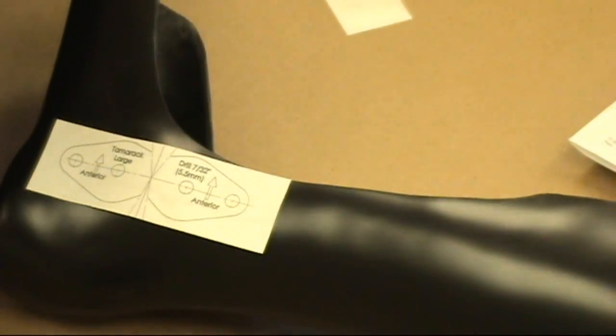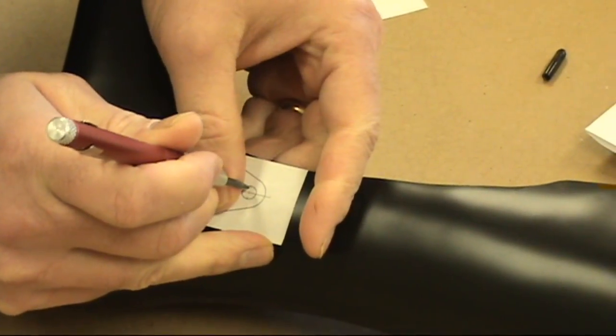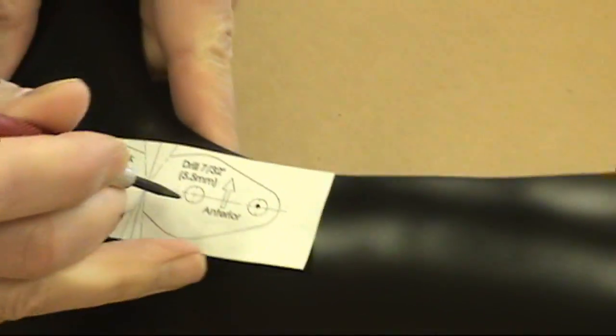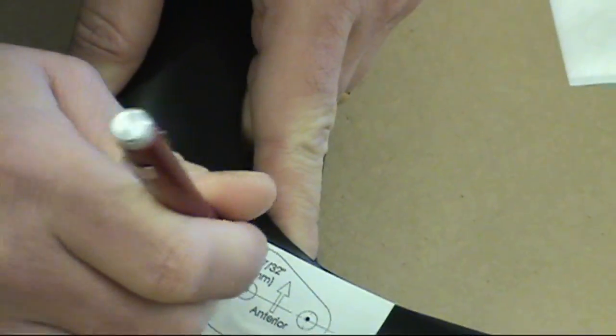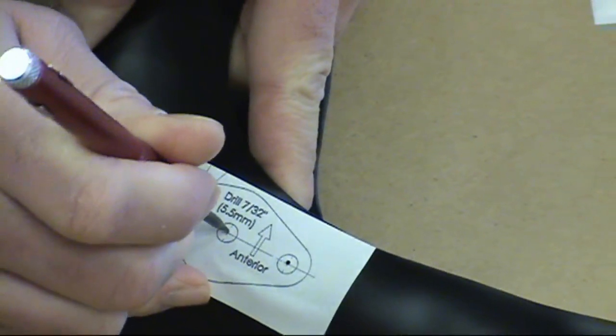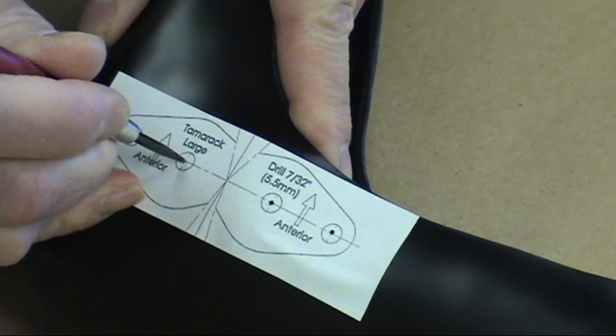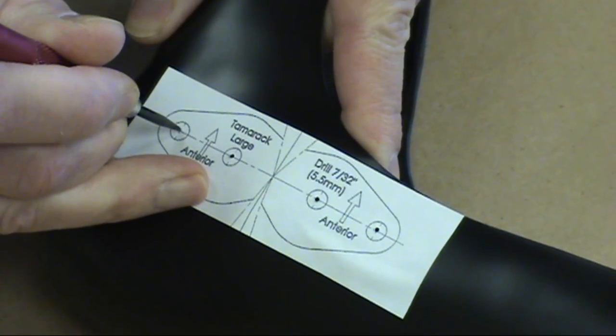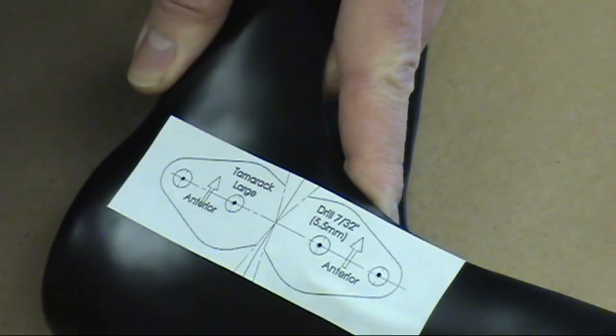Begin by affixing the enclosed drill guide template to the medial and lateral sides of the orthosis, wherever you wish to articulate the device. The drill guide template features trim lines and hole positioning to ensure accurate fabrication and optimal device performance. A punch is used to mark the mounting hole locations. Precise hole positioning is essential to ensure the cap assemblies fit properly.